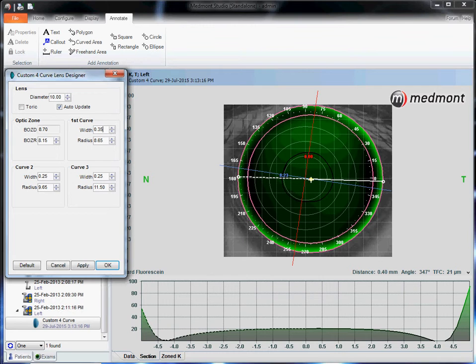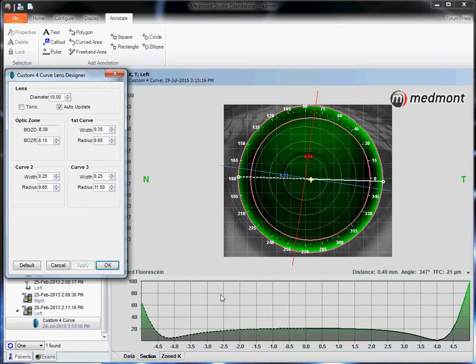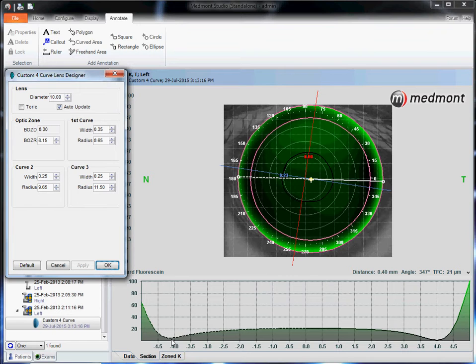So you may find by altering the optic zone size slightly, you find that ideal lens to surface relationship where the base curve is coming toward the cornea, landing softly before the edge kicks in, and we get those peripheral curves bringing the edge up.